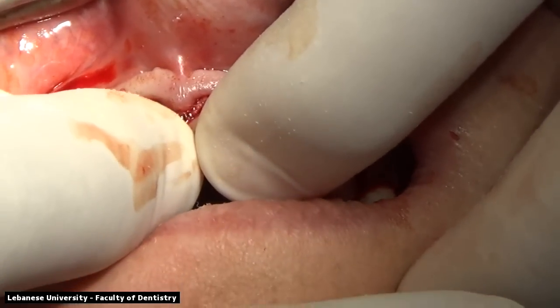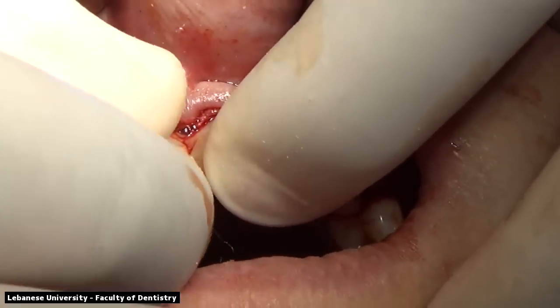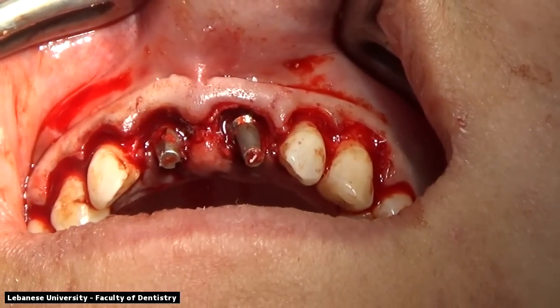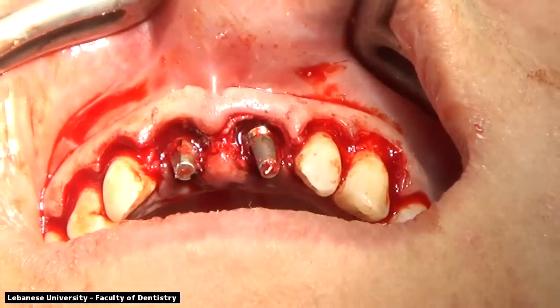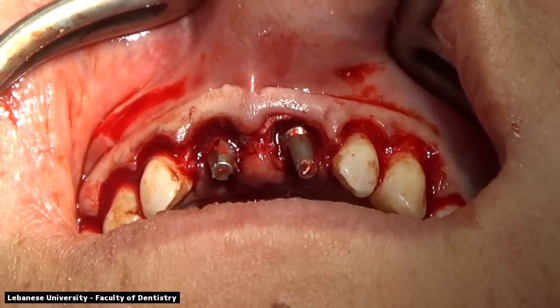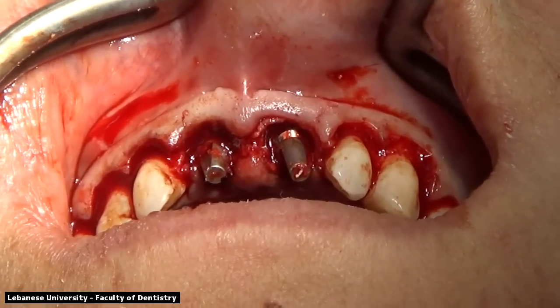Again, we're going for more of an edge-to-edge kind of case with the upper and lower overjet. The patient has a crossbite occlusion. We're doing some final relining of those temporary restorations right now.